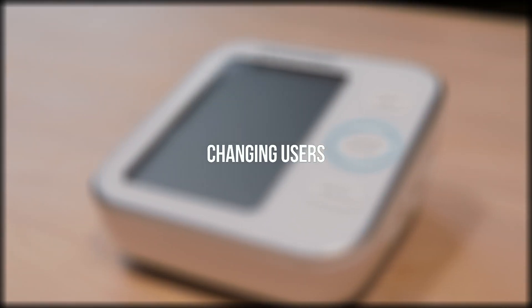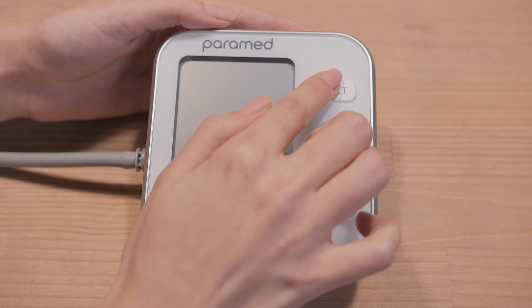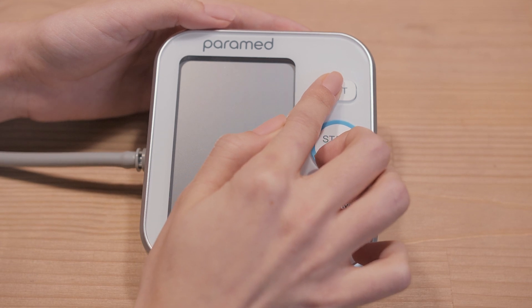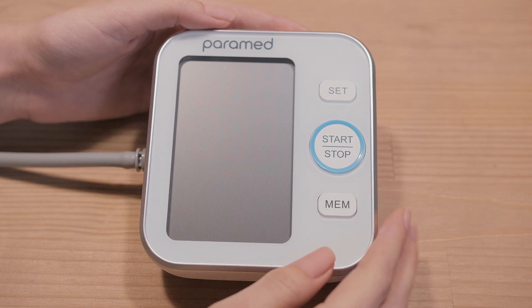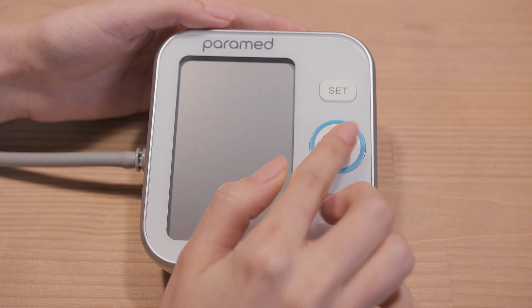2. Changing Users. While the screen is off, press the Set button and hold it for more than 3 seconds. You will see a blinking A symbol on the screen. Press the MEM button. You will see a blinking B symbol. Press Set to save, then press the Off button.